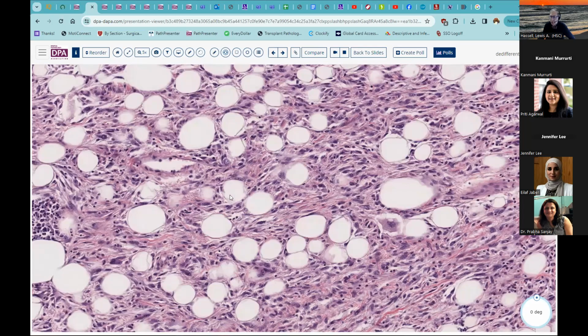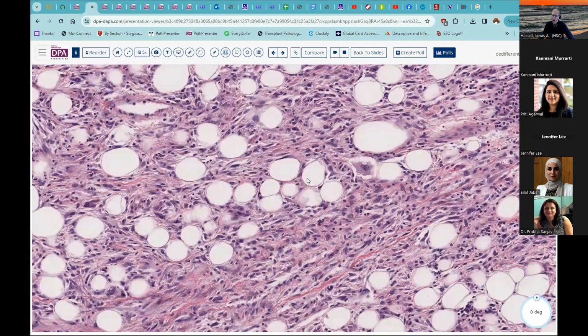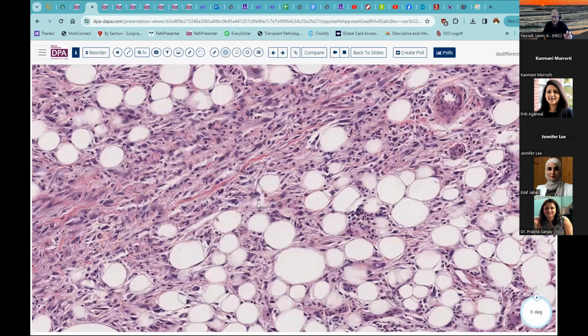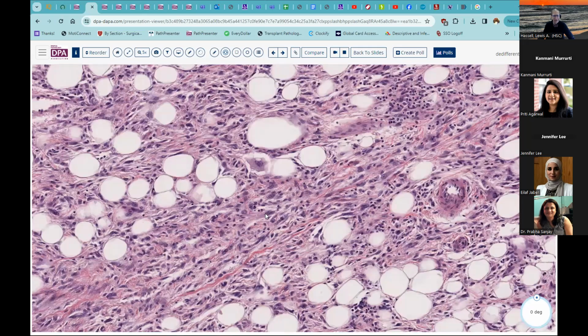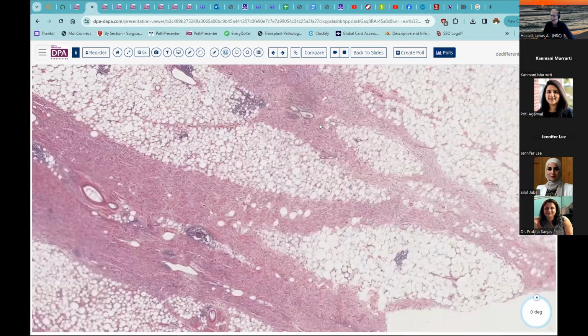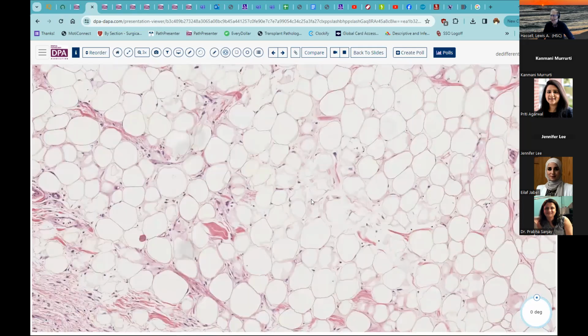You know, I think it's true that they are trapped, and that the tumor cells that are present in well-differentiated liposarcoma are themselves not necessarily lipogenic cells, if I can be so bold. So even here in the more well-differentiated areas that we have in this tumor, down here, for example, the tumor cells are not the lipocytes.